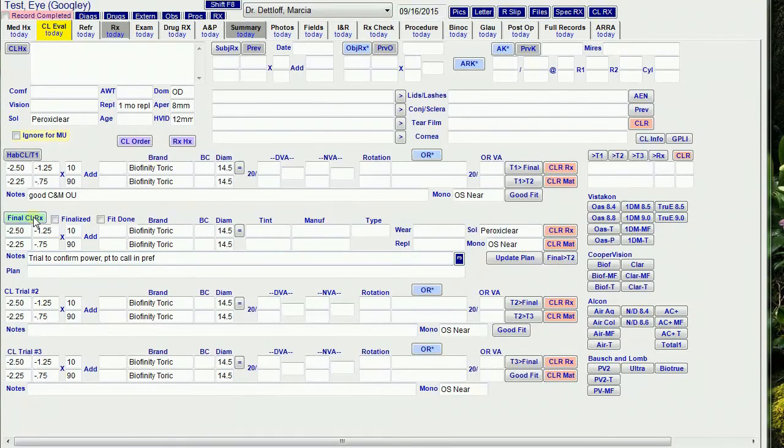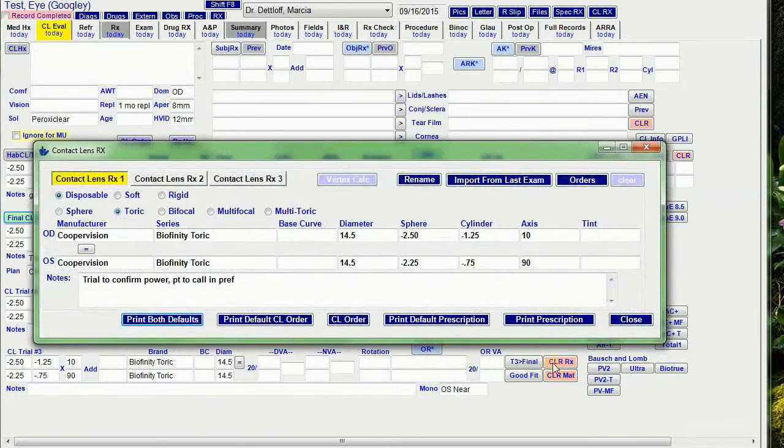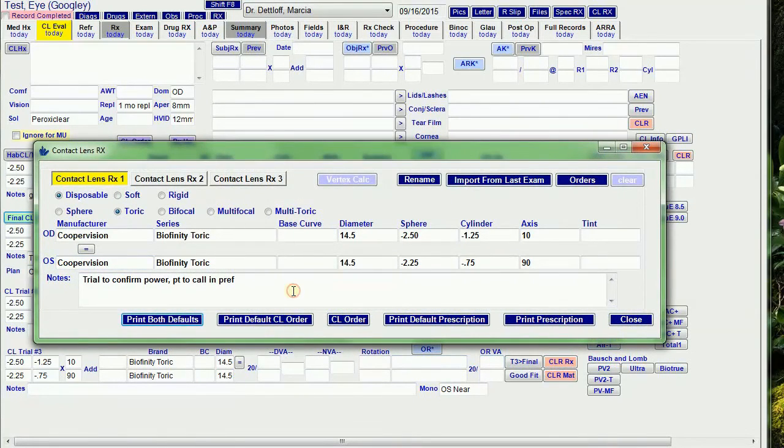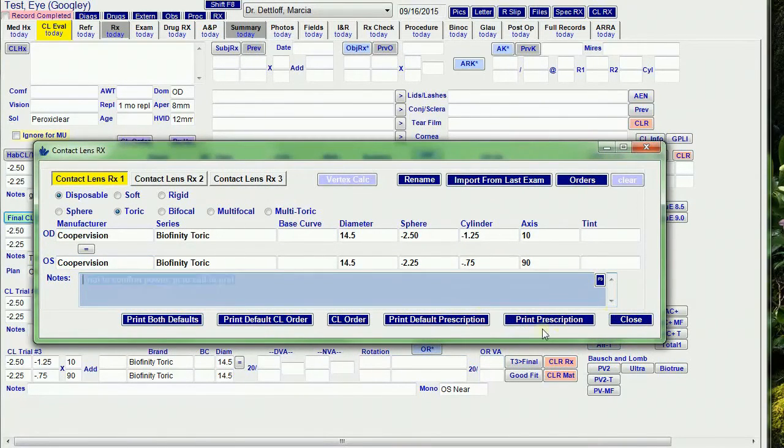Now the final contact lens RX button opens the RX window so I can confirm that the RX is what I want. I can delete or change the notes, and I can order trials or contacts.